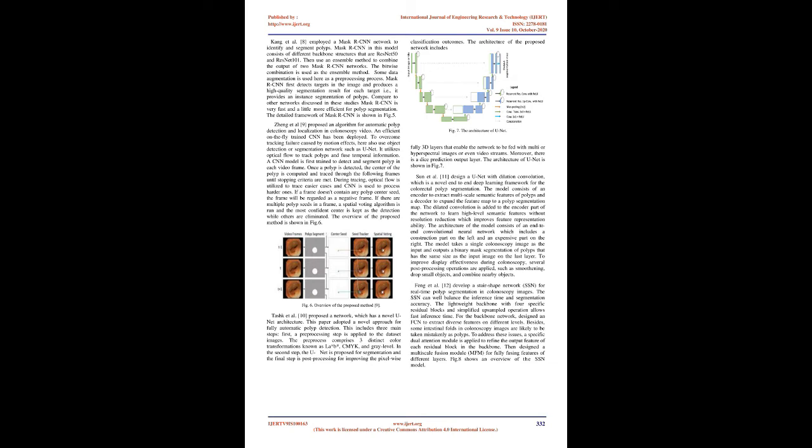Softmax output units and optimized Kullback-Leibler divergence are used for classification. Localization is implemented by predicting the size and location of a bounding box that tightly enclosed any identified polyps. This allowed building CNNs that could operate in real time.